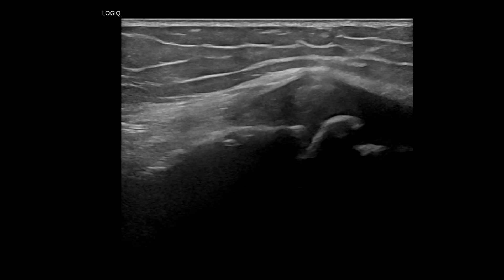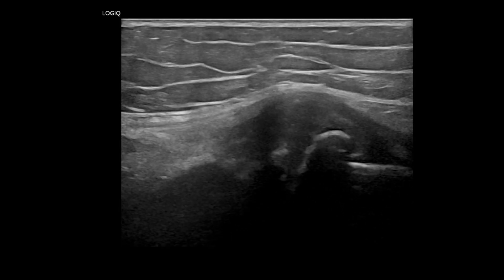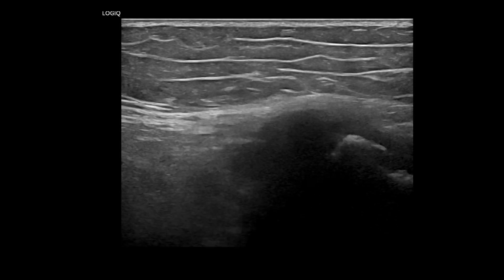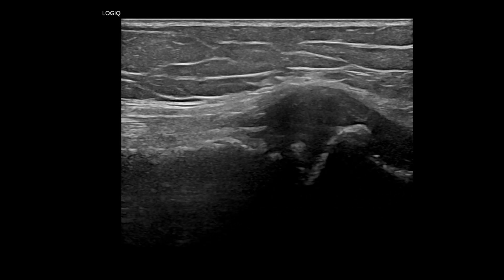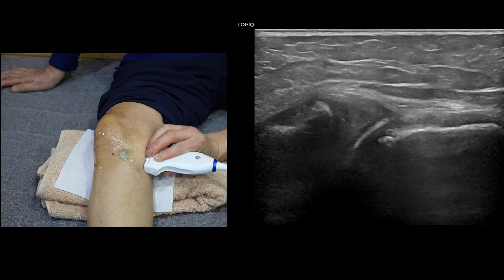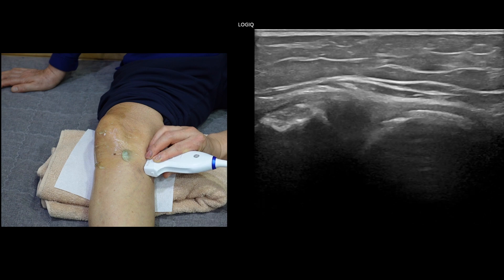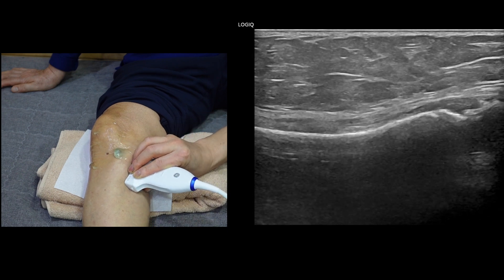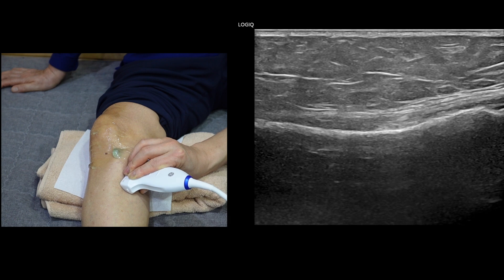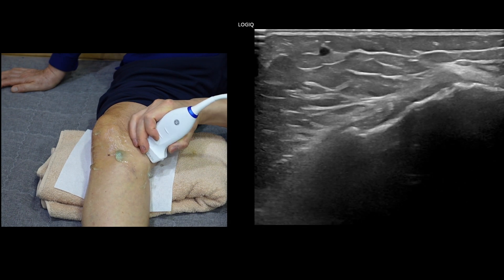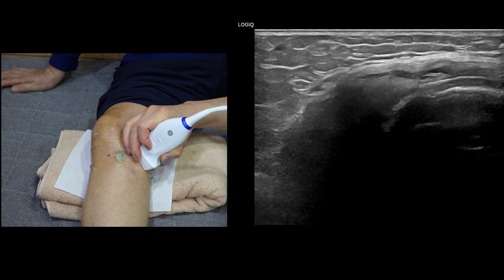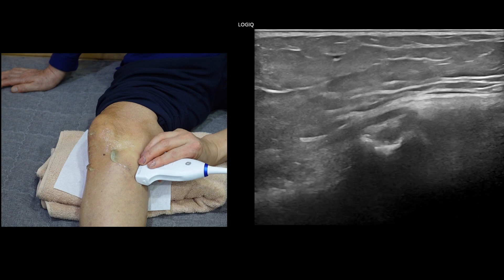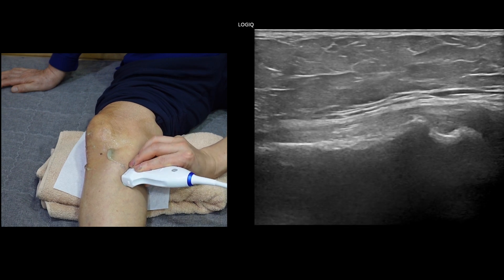A higher degree of bulging and deterioration indicates a more advanced stage. I assess the patient's pain status based on the meniscal grade and the formation of protective marginal spurs. Lastly, I follow the profile of the MCL distally and then rotate the transducer forward to image the tendons of the pes anserinus complex in their long axis. Closely opposed tendons cannot be separated at their insertion on the tibia. While pes anserinus bursitis can be argued as a common cause of medial knee pain, I rarely find symptomatic cases of it in my practice. Therefore, exploring other potential sources of medial knee pain is important.